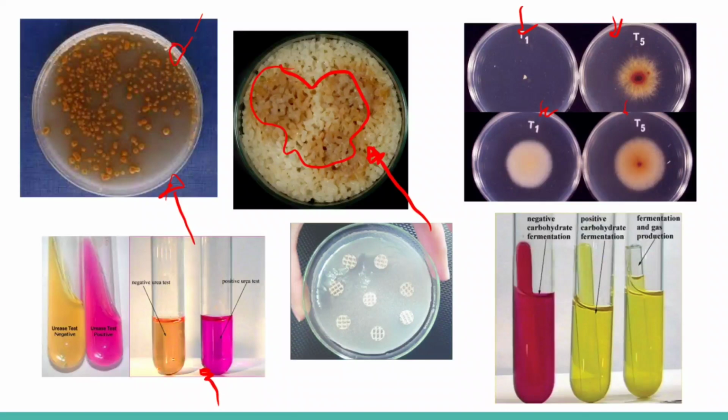Next, the urease. So, ito yung urease broth, and then this is a urease test slant. Okay? Sino yan? Para yan sa Cryptococcus neoformans. So, positive si Cryptococcus neoformans.